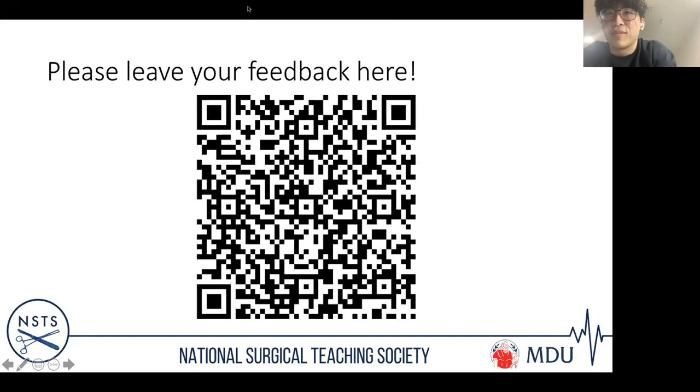uncemented. Okay. I have another question about why a dynamic hip screw is used for intertrochanteric and intramedullary nail for subtrochanteric fracture. The clinical result is that for intertrochanteric fractures, DHS has worked really, really well since 1961. It's still doing well. There have been multiple randomized controlled trials comparing nails to DHS, intramedullary to extramedullary, and no one has managed to show superiority of nails. So for intertrochanteric, that's the case. For subtrochanteric, there's very, very compelling evidence that the nails are superior.